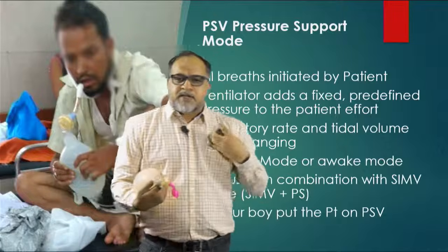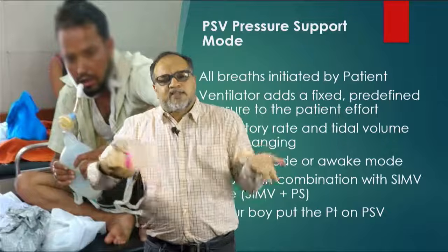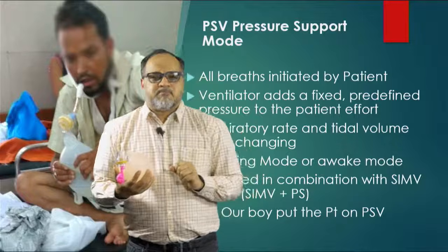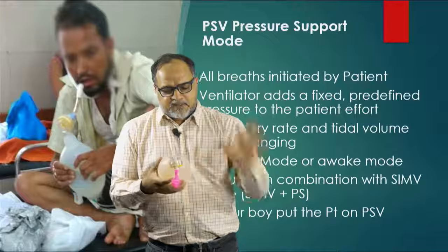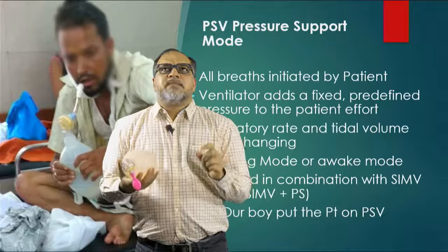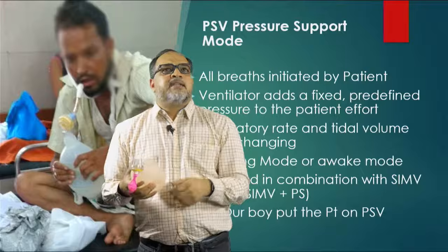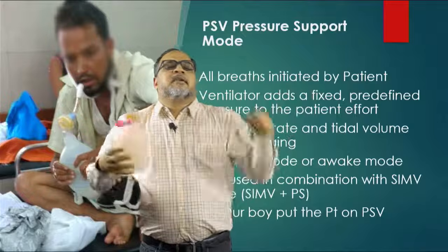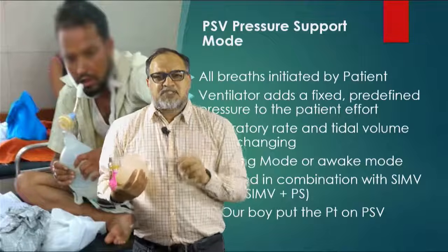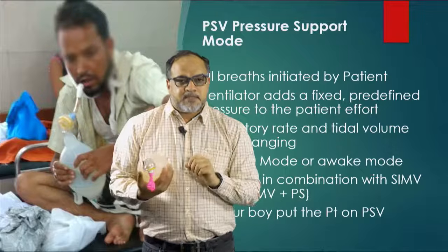So our boy puts the patient on PSV, and everything is going fine. Whenever the patient asks, our boy gives 15 centimeters of water, and everything is wonderful, except for one time. The boy is ventilating the patient, and what happens with all these awake patients is they just keep asking. The patient is awake, he has a tube, and then he'll ask. And what will happen is, at night, especially if the patient is too much troubling, some of the senior nursing staff will eventually sedate the patient.